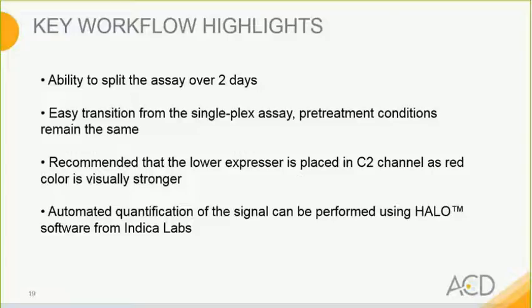Now let's briefly review the key workflow highlights. This assay has the ability to split over 2 days. It's an easy transition from the singleplex assay as the pre-treatment conditions for the same FFPE samples remain the same. It is recommended that the lower expressor is placed in the C2 channel as the red color is visually stronger. Please note both channels are amplified to the same level. An automated quantification of the signal can be performed using HALO software from Indica Labs.